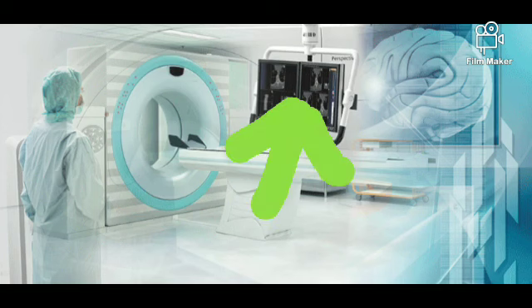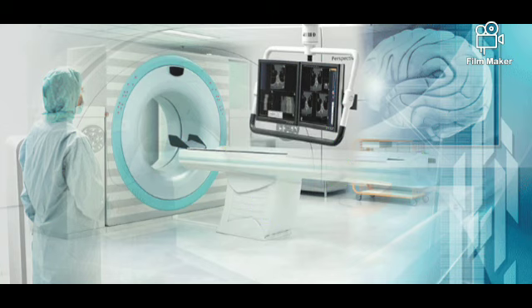and it will prevent movement also. And we have something like knee rest, we have foot rest, which are mainly useful for abdomen, next thorax studies, and in thorax the patient direction will be towards the feet, so that is why the foot rest is useful. So this is what you can see, the image acquisition panel inside the room, which is very much helpful during our biopsy and CT fluoroscopic procedures also.